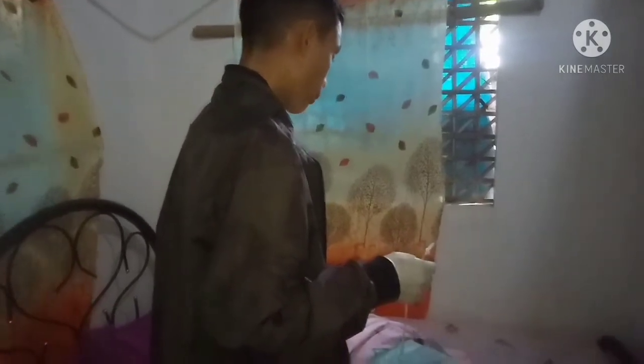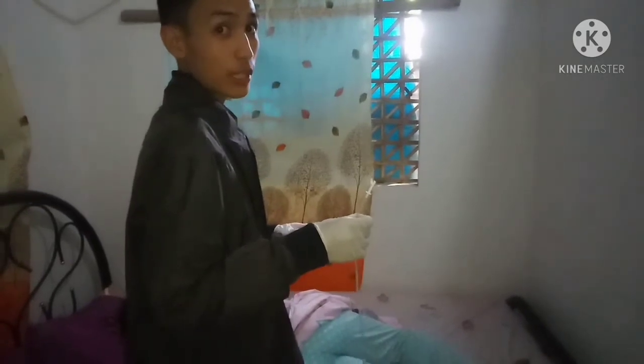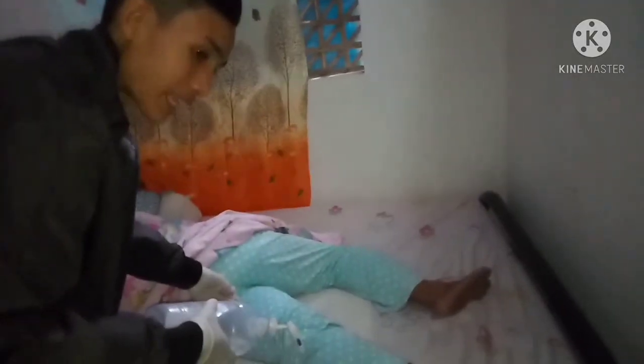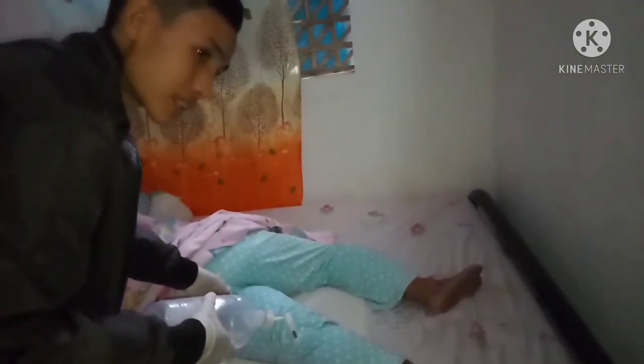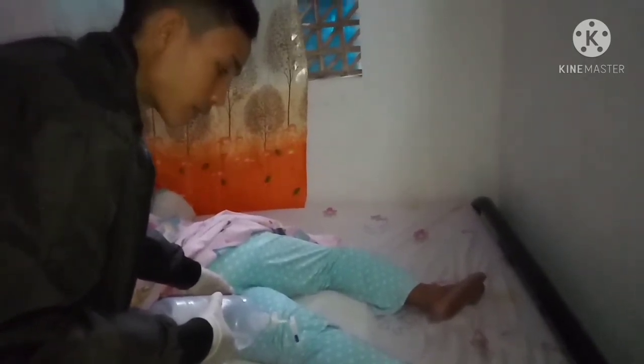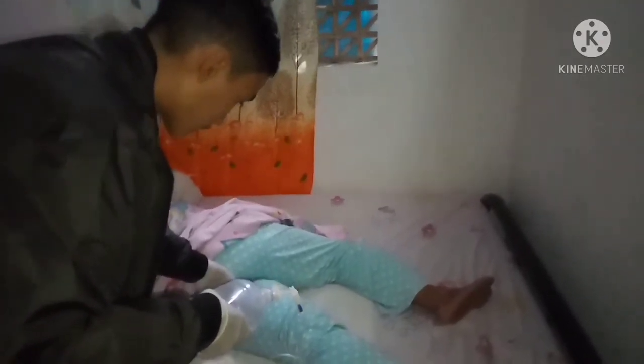So, now, we will insert it at least 3 to 4 inches into the anus of the client. Ma'am, deep breath please. We will insert it now, ma'am. For the pre-packed enema, we need to squeeze the bottle, at least 250 ml, to administer it into the colon of the client. So we will squeeze this until it is all done.